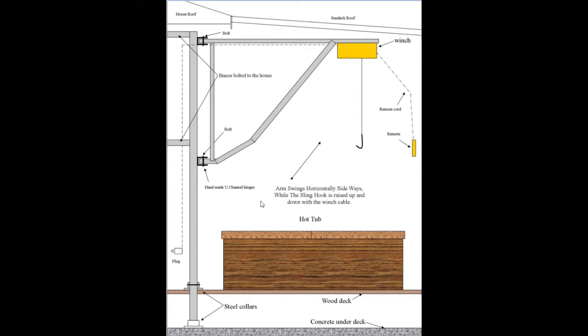Before going to the actual parts and welding, let's go over the plan. The idea is to build this swing stage or crane right beside the hot tub. Starting at the bottom, there's a concrete slab with a wooden deck built approximately two feet above it, in which the hot tub sits partially embedded. The distance from the top of the hot tub to the deck is approximately two feet. So we have to lift Randy from his wheelchair up and over the edge of the hot tub and lower him down into it.